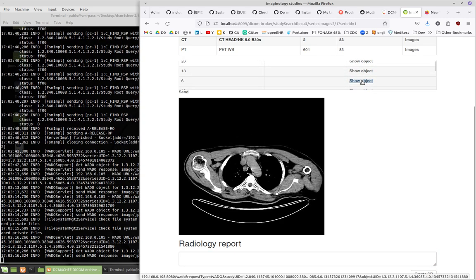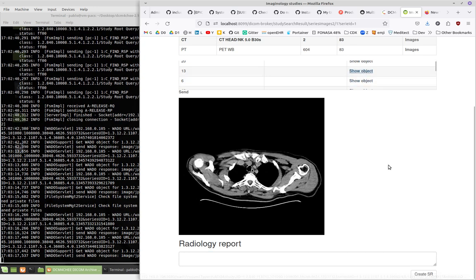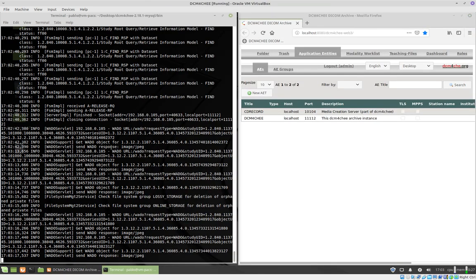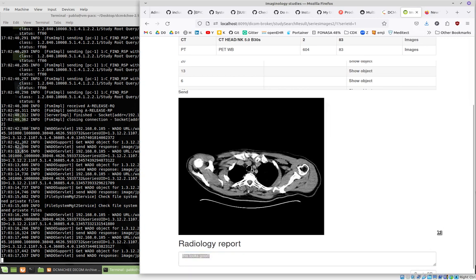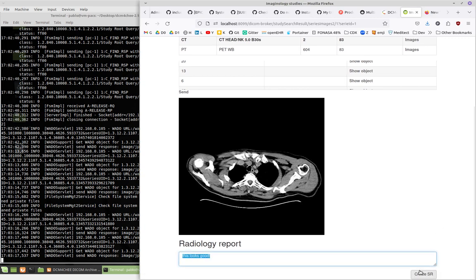That happens. So let's say okay, this is the scapula, etc. So I find this image and I say, this looks good. This could be real clinical data, but I don't need that. And one thing that this does is the application takes this text, creates an HL7 version 2 message, and pushes that message to the PACS. So let's see if this works. I didn't test this in a long time, so let's hope for the best.